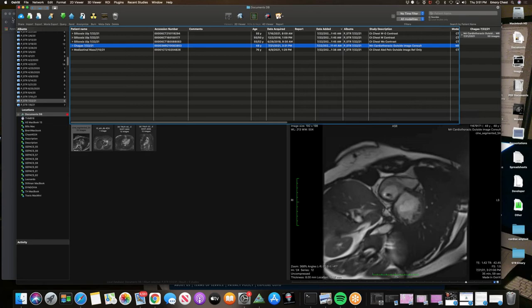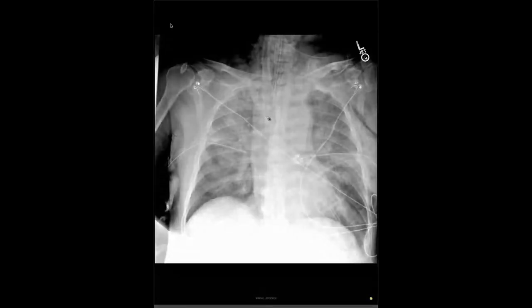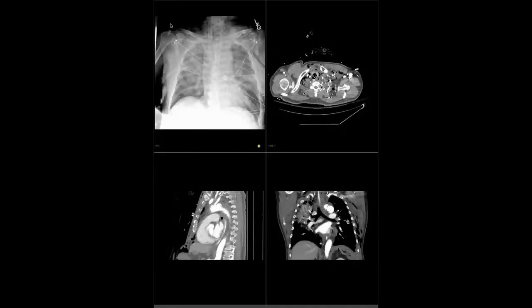All right, so this is a bread and butter trauma case. You can see chest tubes, subcutaneous emphysema, lots of opacities in the lungs, and kind of a widened mediastinum. Here's a right IJ central venous catheter, perhaps pushed off to the right a little bit. Maybe the trachea is a little bit pushed off to the right, but nothing terribly alarming, although the mediastinum does look pretty wide. It's not super dense.